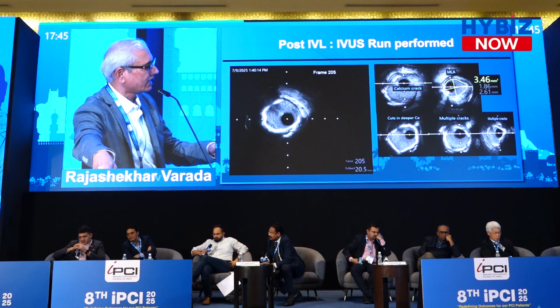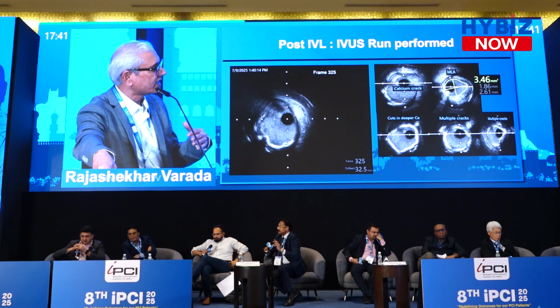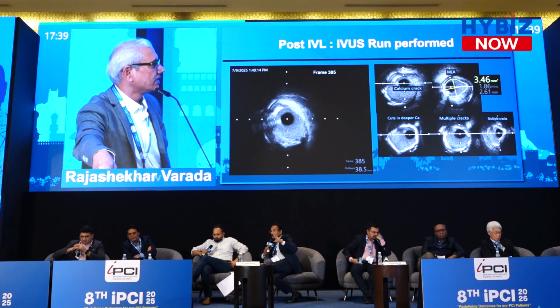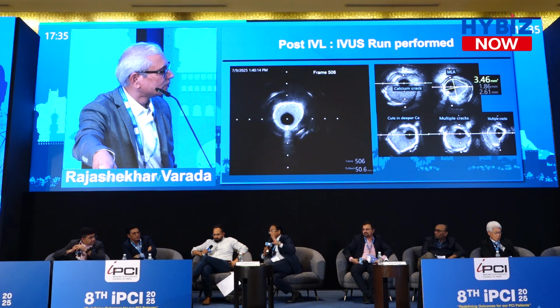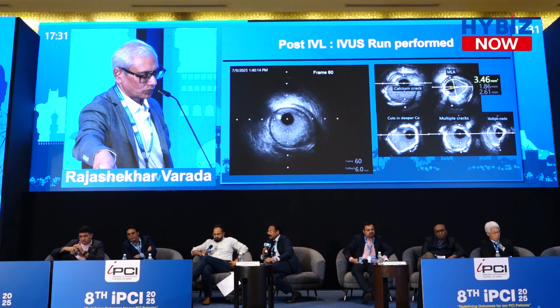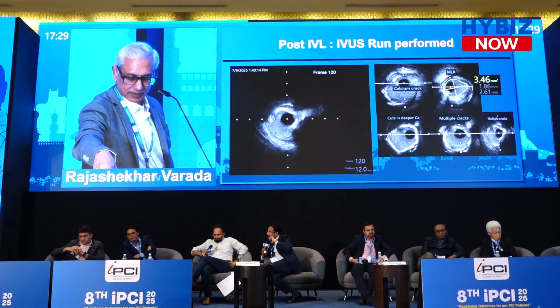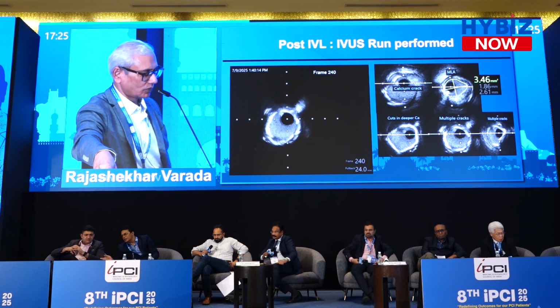So we do it systematically. I mean, it takes a lot of time, but we do it patiently because we want to demonstrate how each step works. IVL plus an atherectomy device seems to be the best strategy or the most balanced strategy in this case. The rota used a 1.5 burr and did not escalate further. No.